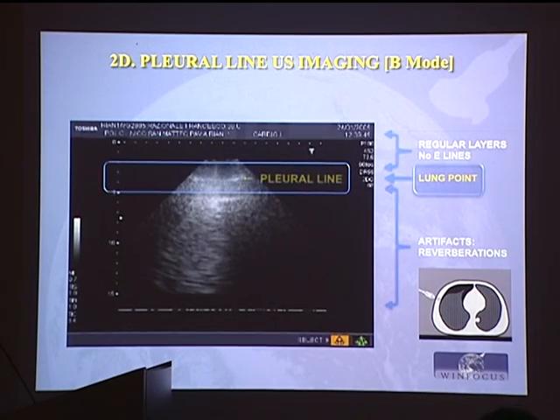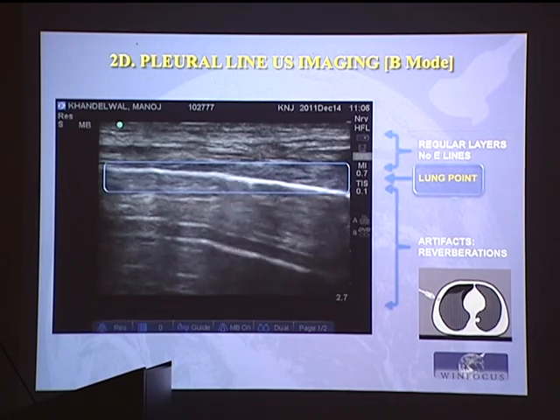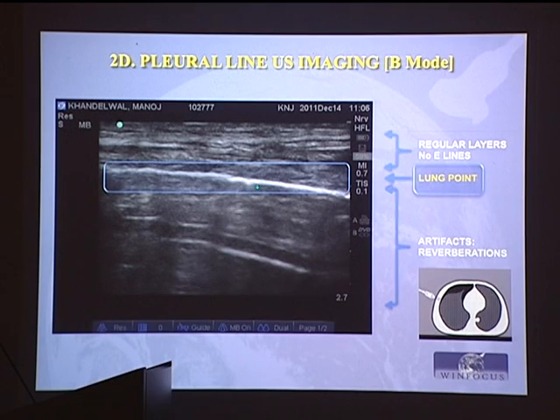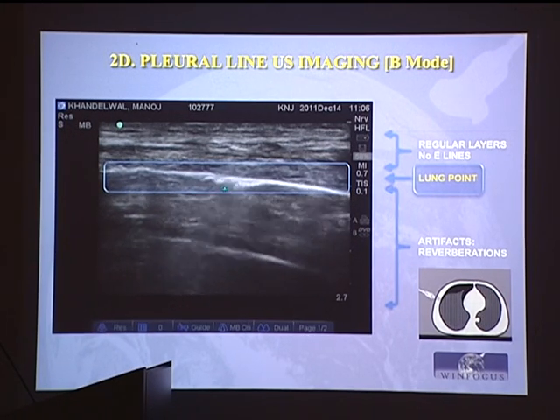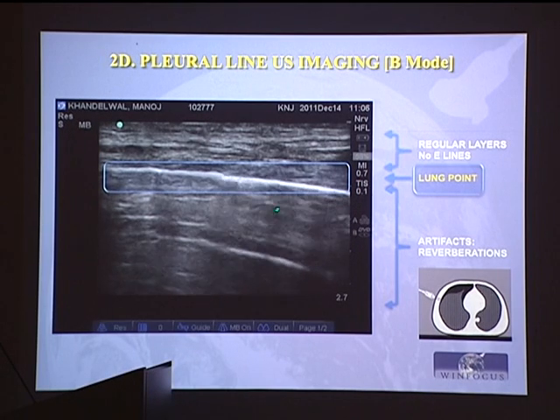I'm going forward. I will describe this maybe better later. Sorry, I just missed a sign that is at the border of the pneumothorax. You see here you can see the lung sliding, and here there is not the lung sliding. If this is consistent clinically with the pneumothorax, this will be exactly the border of the pneumothorax.